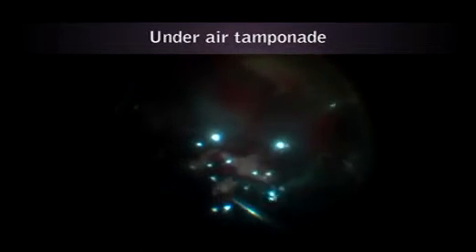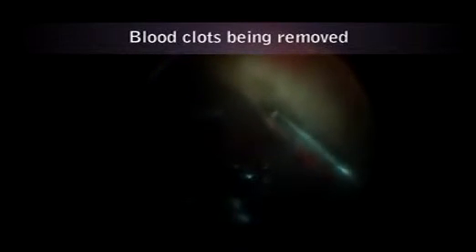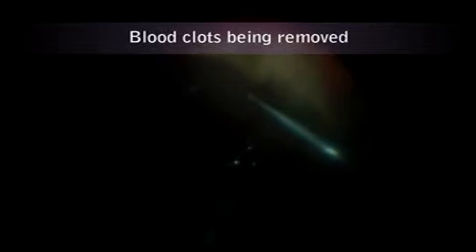In this patient, air interface vitrectomy helped to provide a better view. Endolaser photocoagulation was performed followed by silicone oil injection. At the end of the surgery, the retina was attached and the laser marks were seen.